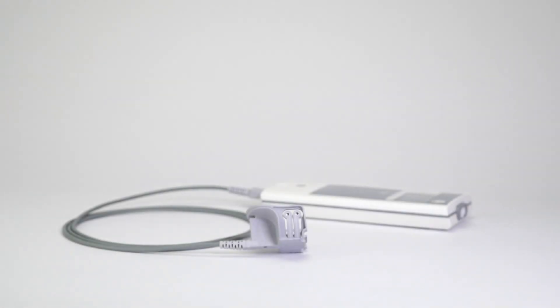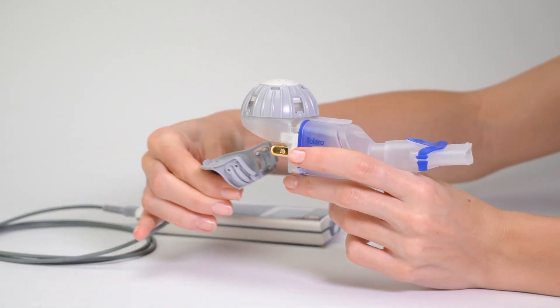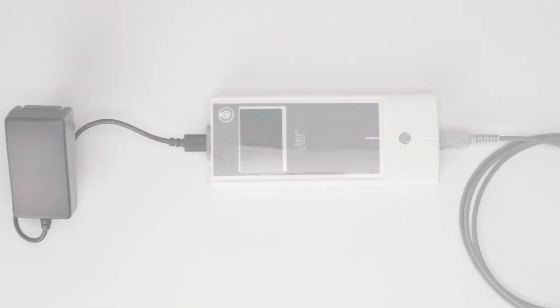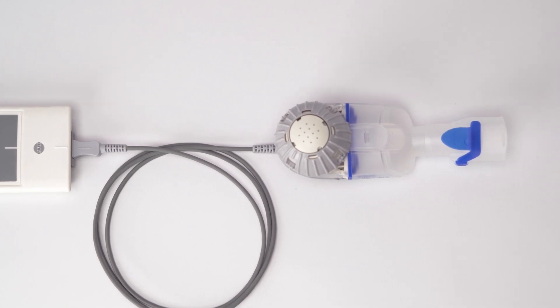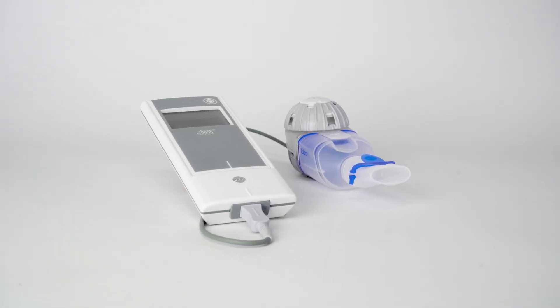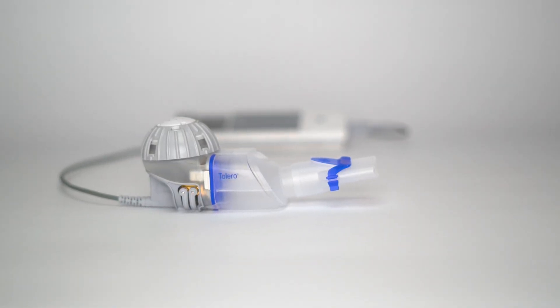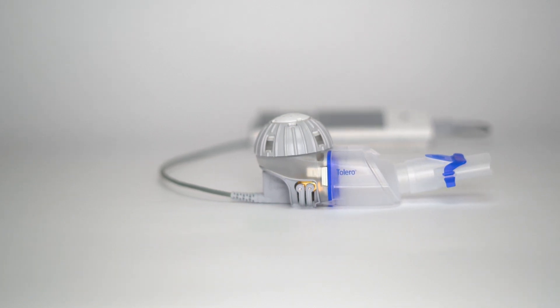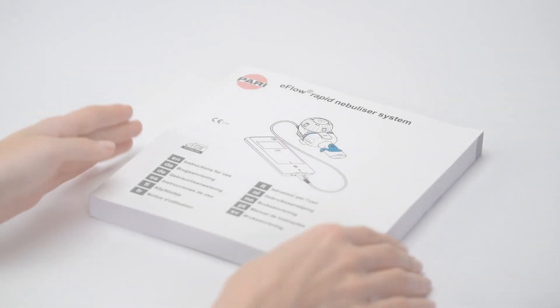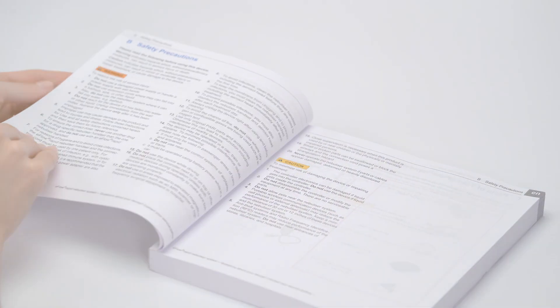The eBase controller is, along with the connection cord, compatible with medication-specific eFlow technology nebulizer handsets, such as Tolero. Please observe the instructions for use for the specific nebulizer handset. Please note that medications approved for inhalation with a medication-specific nebulizer handset must not be used with an eFlow Rapid Nebulizer handset, as this poses the risk of incorrect dosing. Always observe the instructions for use when using your eFlow Rapid Nebulizer system.